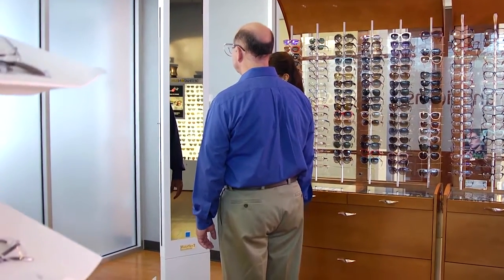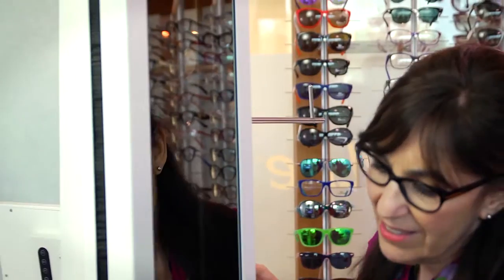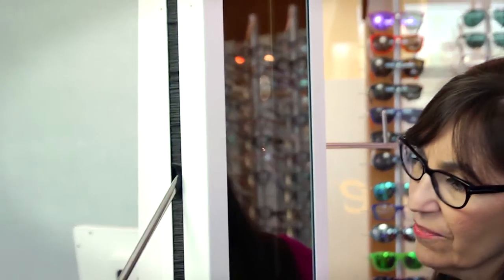After the camera is adjusted, fully raise the arms from the sides of your VisiOffice 2 system.